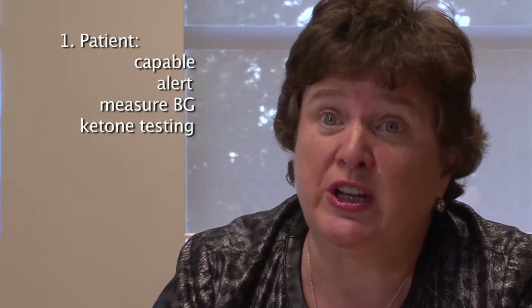If they're hyperglycemic, so their sugar is greater than 14 millimoles per liter, they have to have access to keto testing, either capillary blood testing or urine testing, and have to be able to act upon the results. They have to be willing and able to change their pump site if necessary. And they have to be competent in pump management. Presumably we would be if they're on the pump for a long time. And most critically, they have to have adequate supplies to get them through their hospital stay. If they don't have an adequate number of infusion sets and reservoirs and batteries, even if they want to continue, it's not safe to continue because you don't want a sudden crisis of the pump stopping.